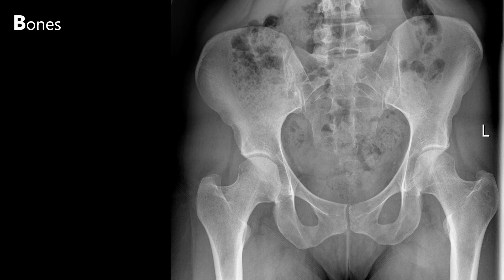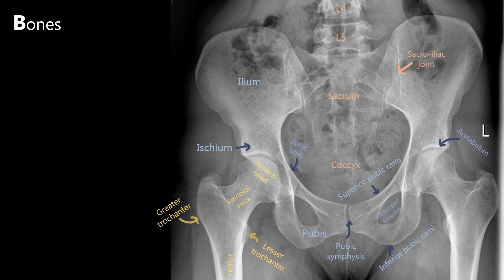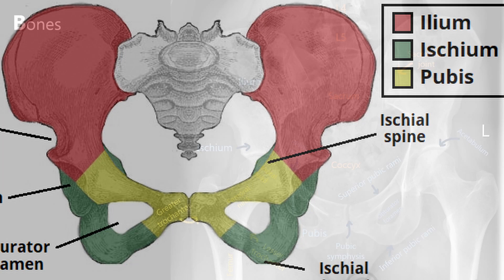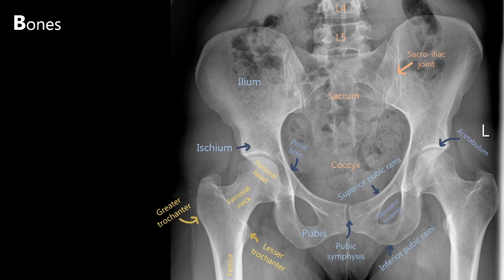Next is bones. For this, we need to know the bony anatomy as highlighted here. We should be able to visualise the lower lumbar vertebrae, sacrum and coccyx. The pelvis is also visible and is split into three anatomical parts: the ilium, ischium and pubis. The two femurs communicate with the pelvis at the acetabulum, forming the acetabular joint. To assess bones, we need to systematically go through each bone, assessing the outer cortex and bony texture, comparing left and right for any asymmetry, which will help us pick up on abnormalities.